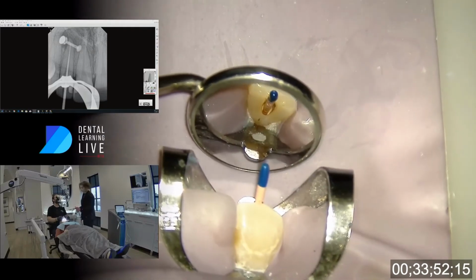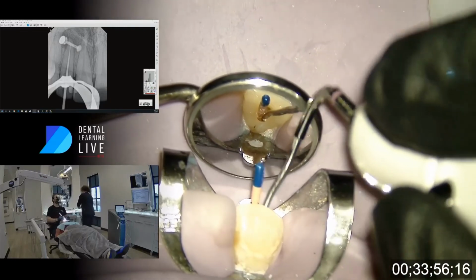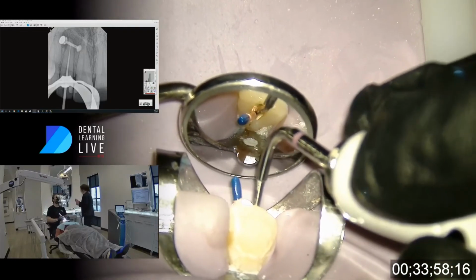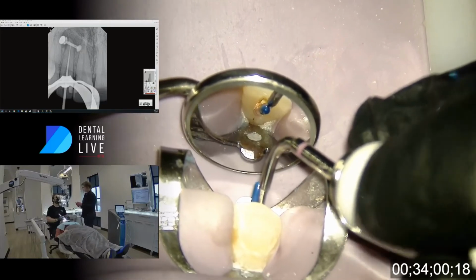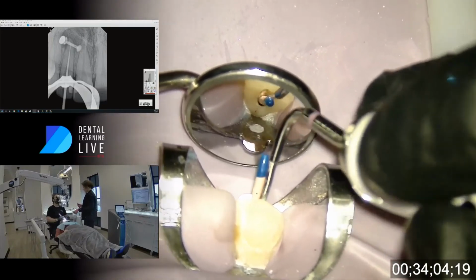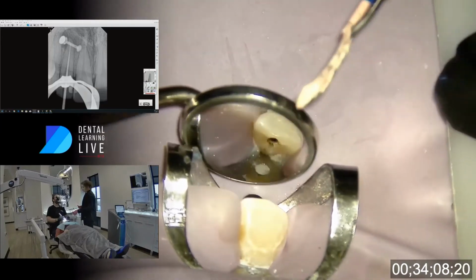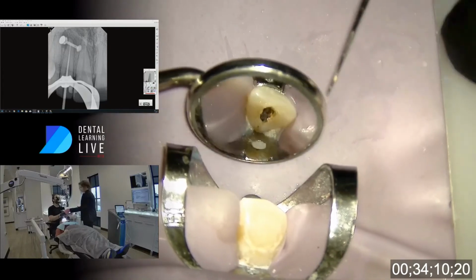Okay, and single cone technique is an option. A lot of users are doing that. I don't. I am going to do a modified continuous wave here. Basically, I'm just searing this off and compressing as much as I can, as far as I can.